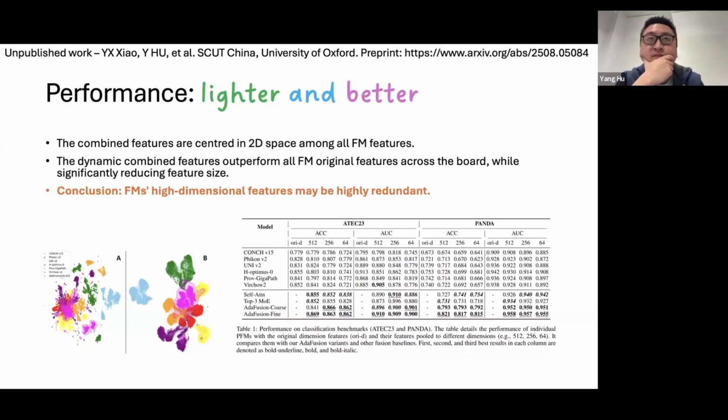So if you're predicting them all as one class, which is the majority class, you would sometimes get 70% accuracy, or even AUC would get a very high percent. But when you look at the other metrics, it would differentiate. If you look at the AUCPR, you would see whether the model is actually predicting it or not. So I'm not sure if you looked into that as an explanation of the scattered heat maps that you showed earlier. Maybe they are all just not looking at something very useful. They're just all predicting the majority class, and that's it.